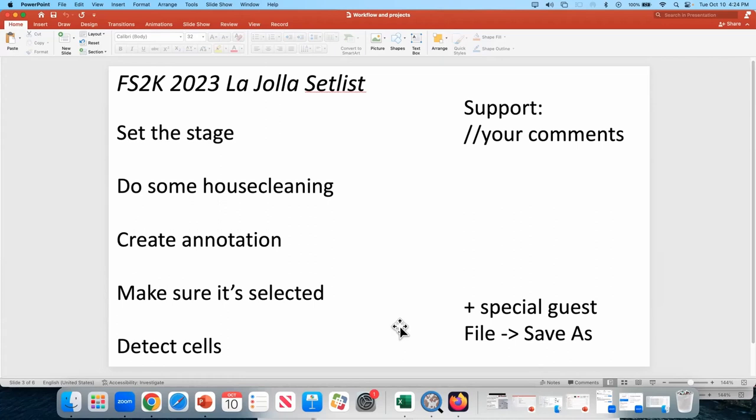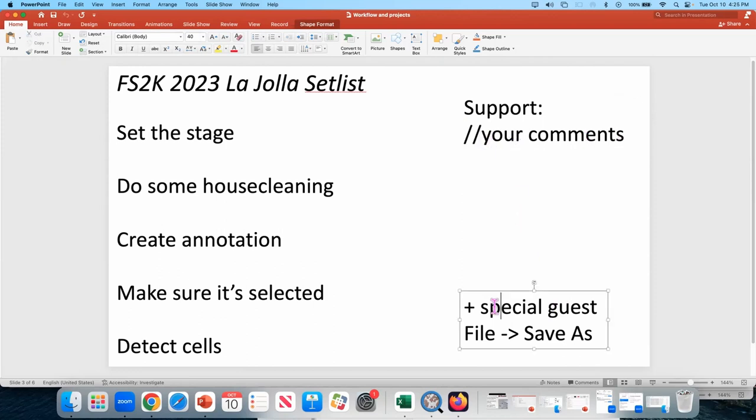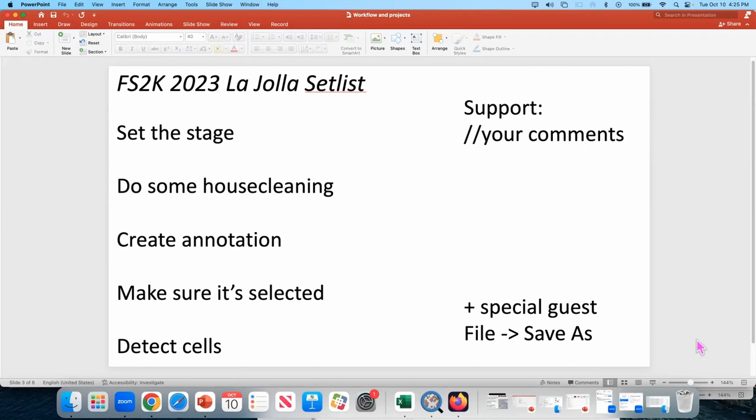But this is from samples to knowledge 2K 2023 to La Jolla set list. Because the following songs will be played in that script. We're going to set the stage. We're going to do some house cleaning. We're going to create annotations. We're going to make sure that annotation is selected. And then we're going to detect the cells. Support band is called your comments. And it has this funny name. There are two slashes in front of your comment. And a special guest is File Save As.